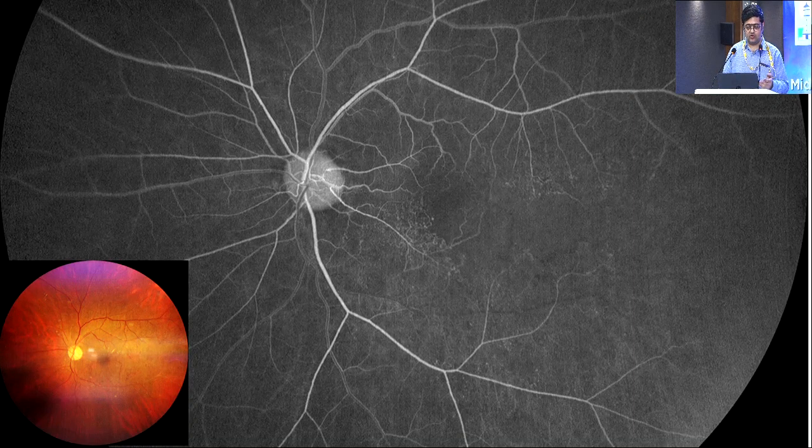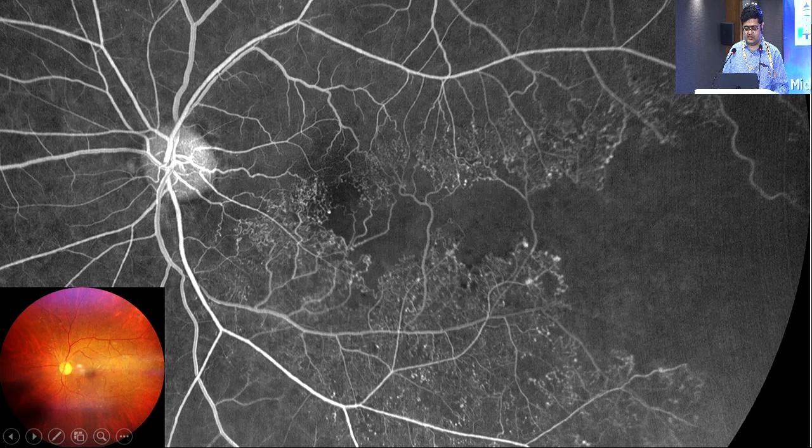we went ahead and did fluorescein angiography for this patient. As we can see over the course of time, these are the collateral vessels joining in the superficial plexus that we are noting, one over here, one over here, and one over here. But we do see some amount of microaneurysms in and around this, and if we comment on the foveal avascular zone, it is distorted in the inferior, close to 120 degrees.